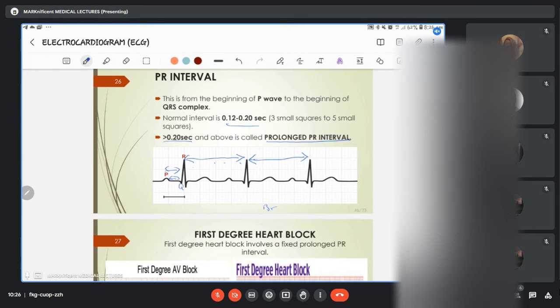So that's reduced heart rate. Anyway, that's just by the way. I'm just trying to bring back what we've done to revise here. So this PR is now prolonged, and then you can start thinking of, okay, the P is sinoatrial contraction. That is the atrium contracting, I mean.